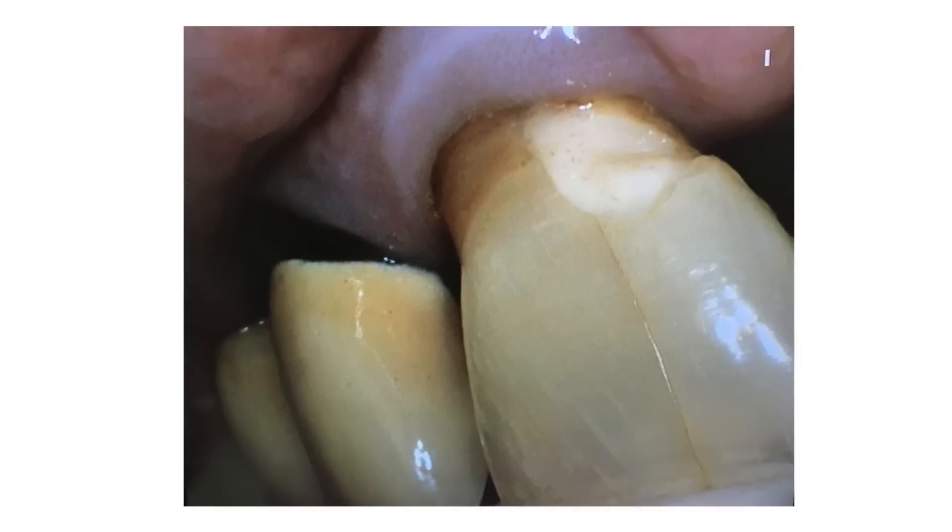Hello everybody, it's me Janet again. Today we will make a tooth filling. The preparation will be almost painless and very, very fast. First of all, we will have a look at the picture. Now you can see our problem. It's an anterior incisor. It's very, very difficult to get the dental filling to hold on the surface, and the second problem is it must look very, very good because it's the anterior area.